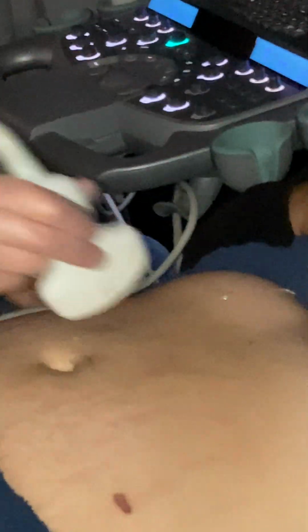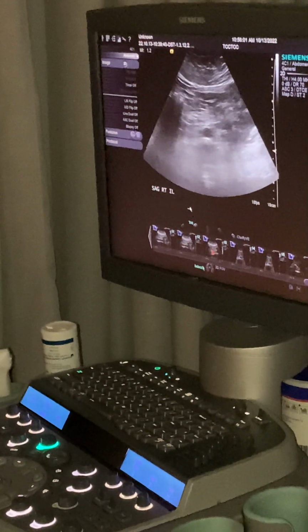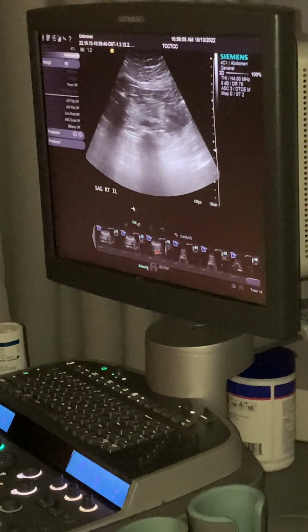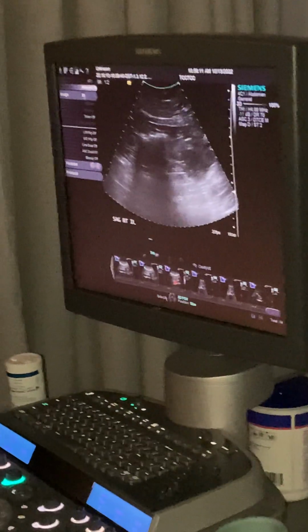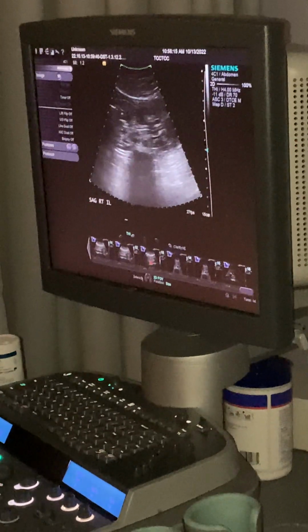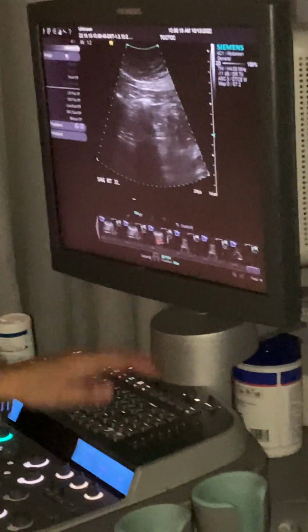Okay, so let's find him again. So you can do, what did I push? What is even happening right now? I'm going to guess. Well, our settings got all reset for some reason. So here was our transverse. Ooh, less tab. What just happened? Okay, so here we are at our distal.